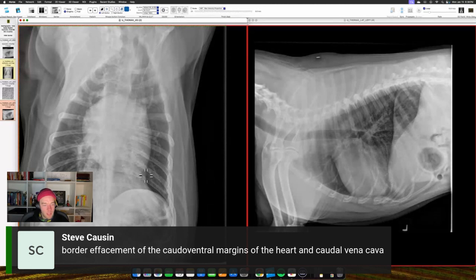There's a caudal ventral mediastinal reflection that is this normal little band right here. And this dog's caudal and ventral mediastinum is chock full of fat. So the combination of fat, the expiratory bump of the cupula of the diaphragm, and the apex of the heart sitting here has allowed a little bit of overlap in that area, and you don't get the normal interposed gas to create that margin, okay? It's good to be aware of this because you can see accessory lung lobe pneumonia. I've seen barbecue skewers go from the stomach through the liver into the accessory lung lobe, and it just creates this nice little pus pocket. But that's the caudal ventral mediastinal reflection.